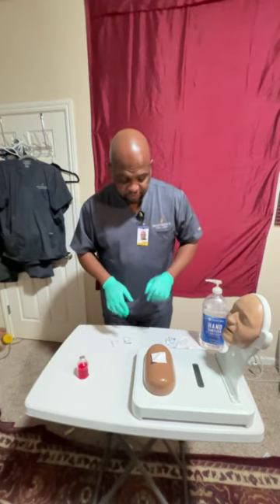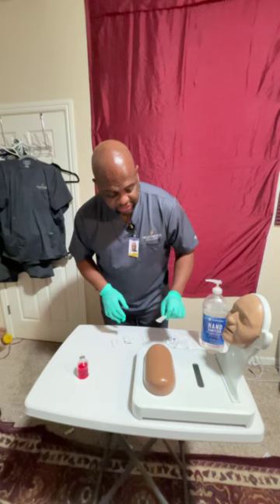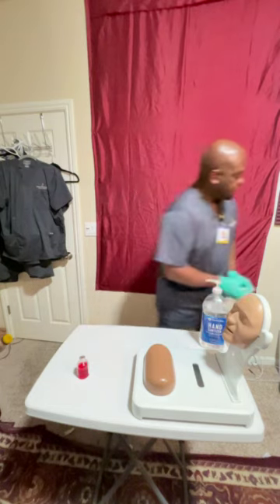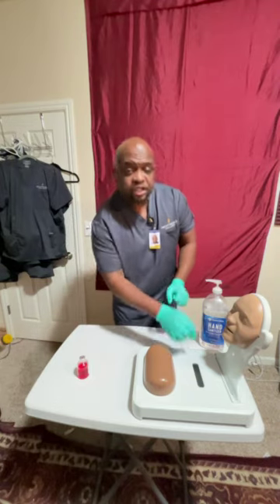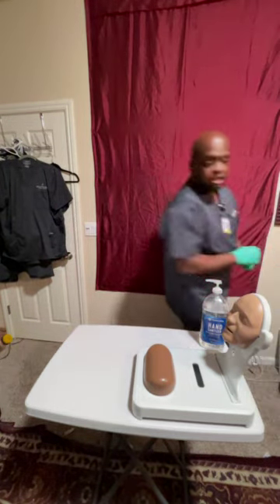And then from there, I'll check on the blood. There's no blood, no bleeding, anything like that. Okay, good. Then from there, I'll clean up the area. Ask the patient if he's okay. How's he doing? Then I will give the patient a call light. Get my medication out of here. Over there. Give the patient a call light.